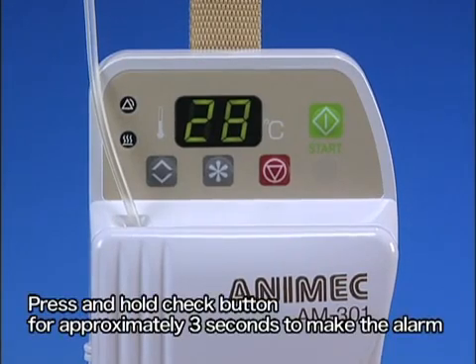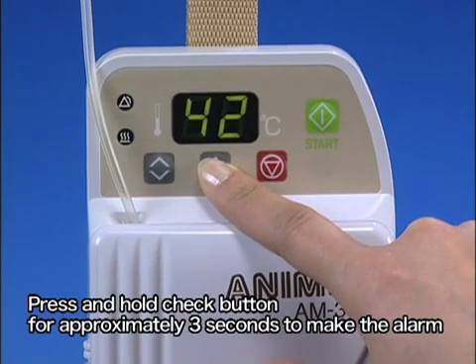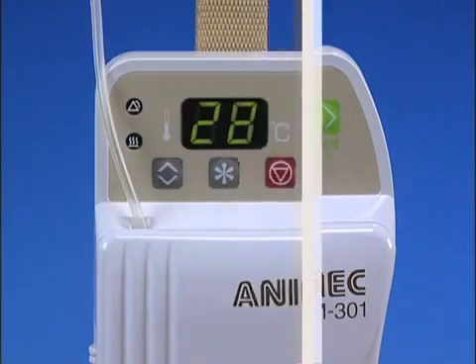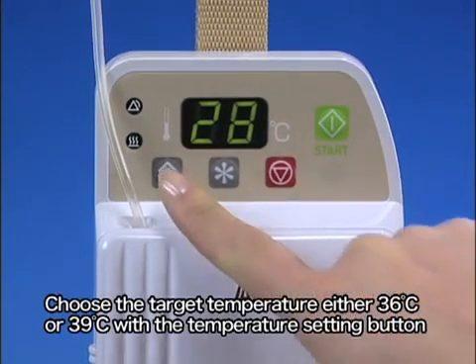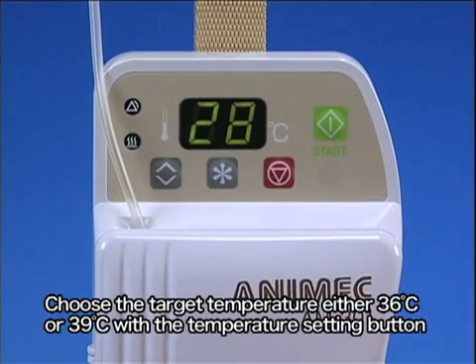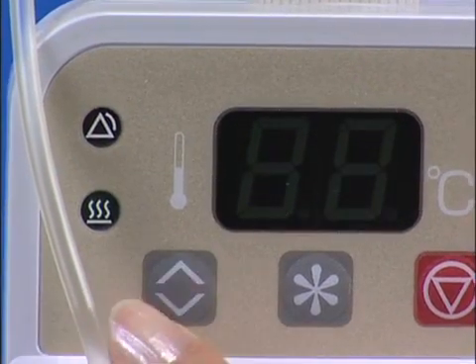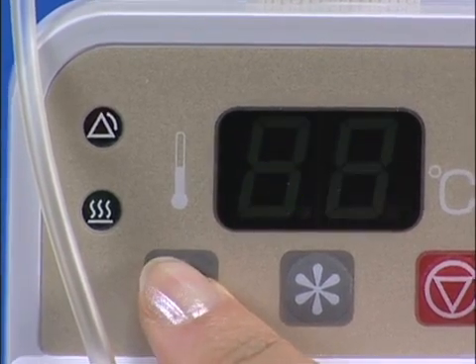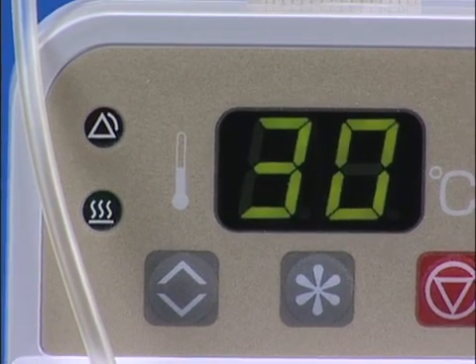Turn the device on and set to standby. Press and hold the check button for approximately 3 seconds. Listen for the sound, look for the light, and check that the display is at 42 degrees. Choose the target temperature, either 36 or 39 degrees Celsius, with the temperature setting button. The display alternatively flashes 36 and 39 degrees Celsius for approximately 3 seconds when the temperature setting button is pressed, and then indicates the present temperature.